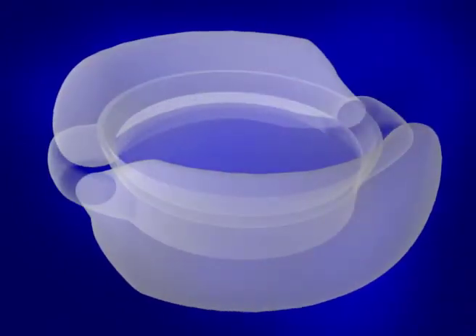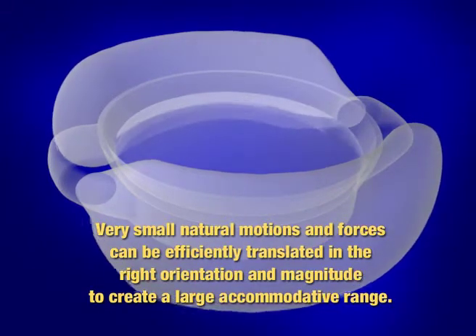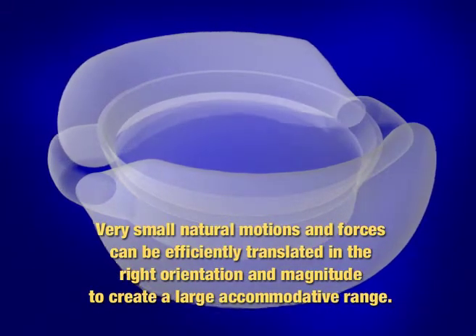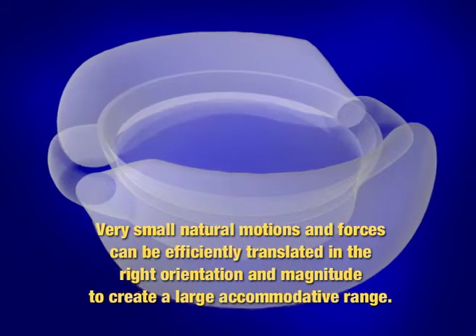It is important to note that with the unique fluid-driven system, very small natural motions and forces can be efficiently translated in the right orientation and magnitude to create a large accommodative range.